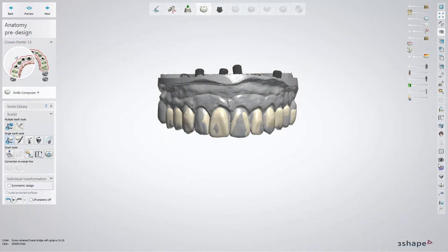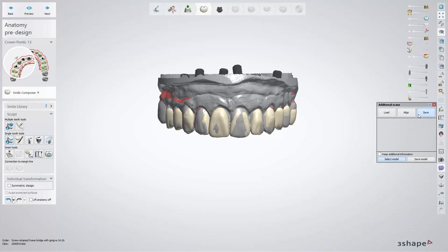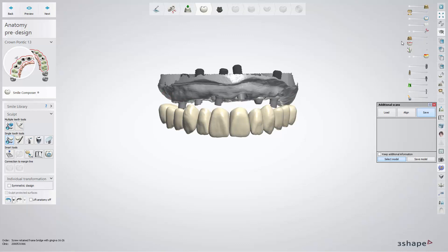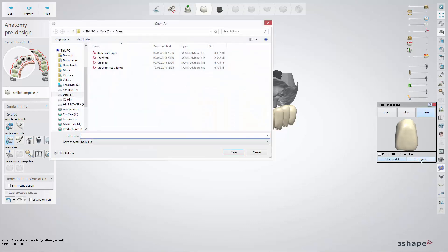The Save button gives you the possibility to save everything that you can see in the Design window, except encrypted files like the Implant Library or the specific Anatomy Library. Click Select Model, then select the item you wish to save and click Save Model. Then give a name to the file and choose a location to save it.